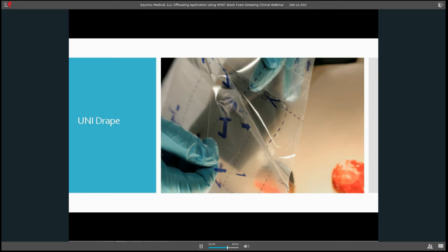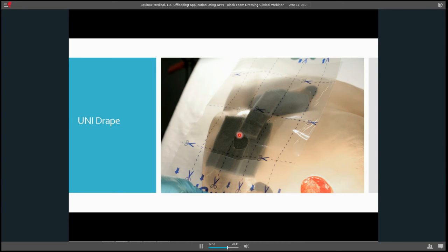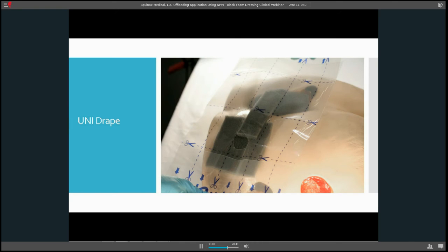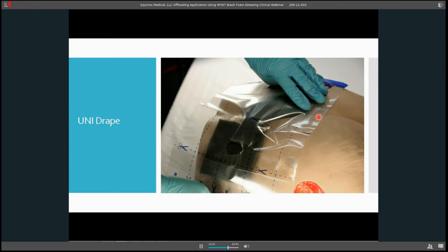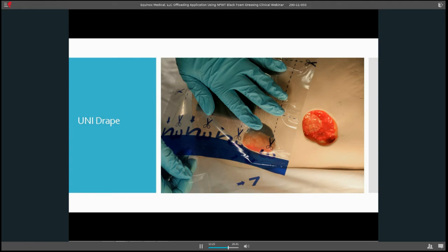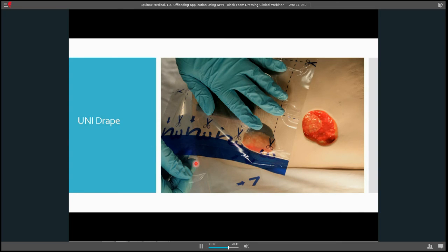So here's my hole in my unidrape. I think this is probably one of the easiest drapes I've worked with. It's a 1-2-3 system. If it's done right, the nurses will never have an issue with it sticking to their gloves. Here I'm peeling off number one. I'm flipping it over and I'm placing my nickel-sized hole down in this area. Then all I'm going to do is smooth out around the area. A little too much drape, but the drape doesn't always stick really well to the wound butt, so you have to get a little bit of extra on there to make everything work. I'm following the curves of my body and I am not compressing. I'm not putting my hand over here and compressing this down. There's no need to. I'm going to let my negative pressure do that.